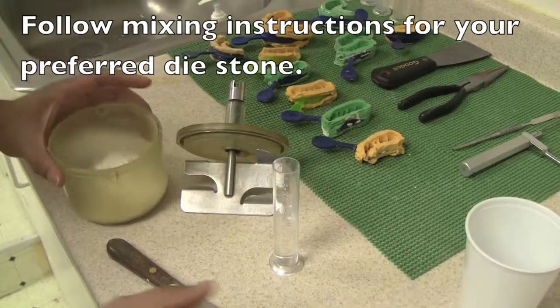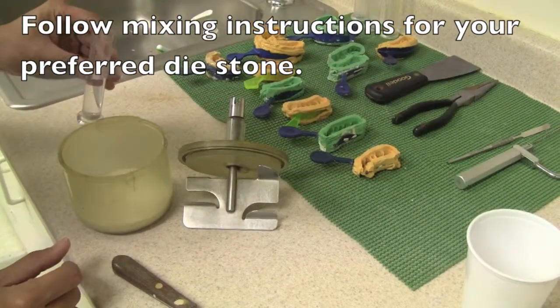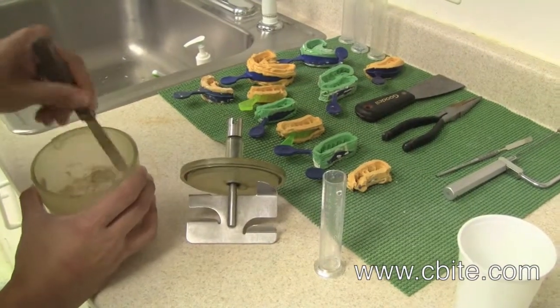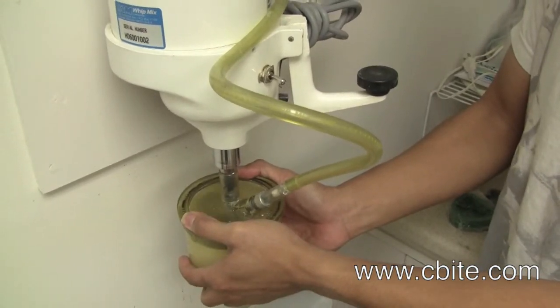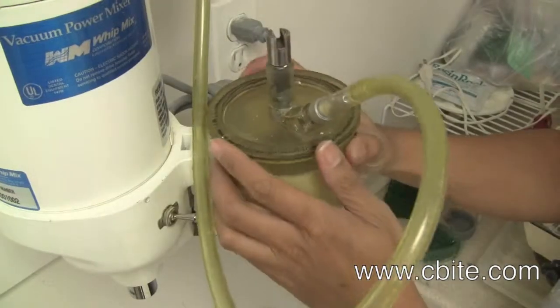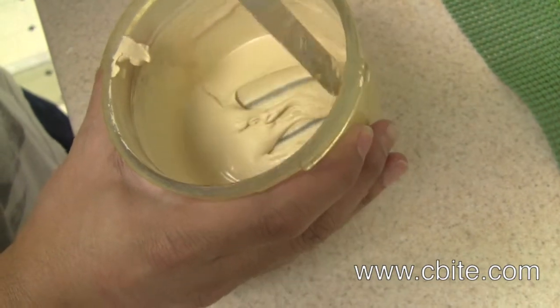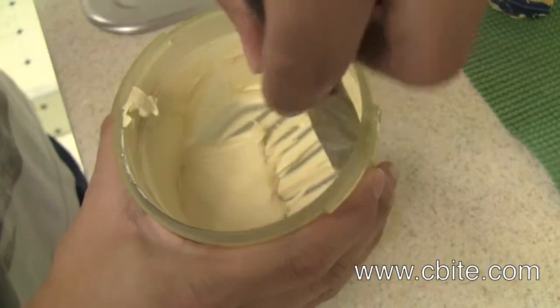70 grams of diastone, mix it with 14 milliliters of water. This is now the consistency of the stone and we're ready to pour the impression.